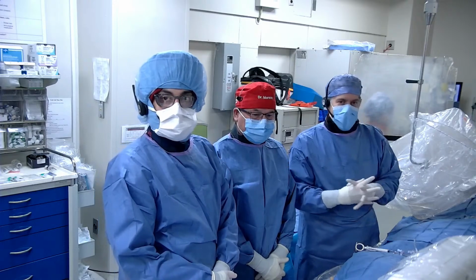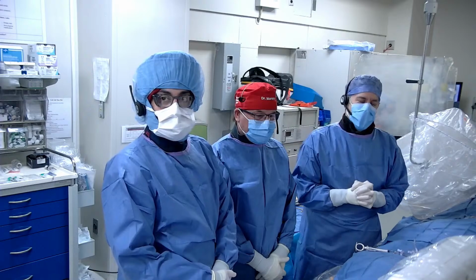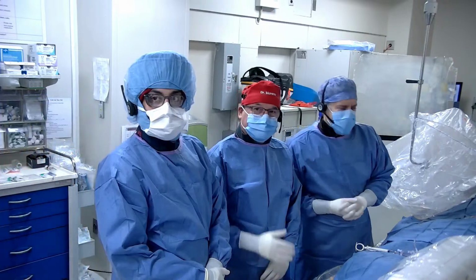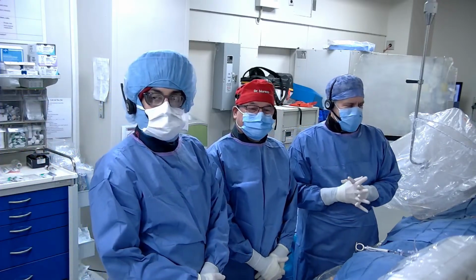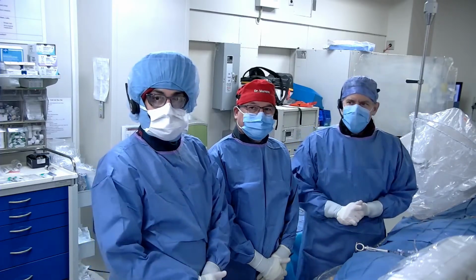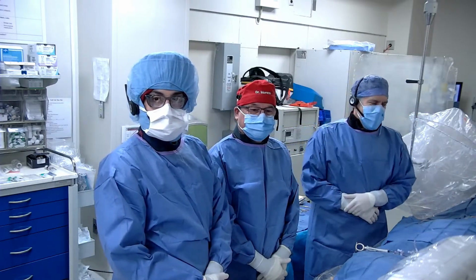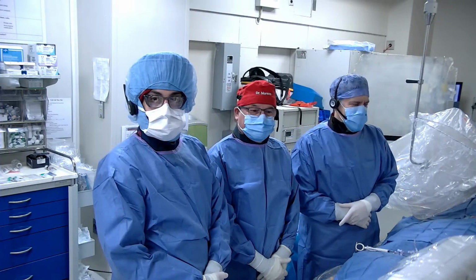I really want to thank my guest moderator, Dr. Nat Smilowitz, who's coming up from NYU. In the room, we have a full team here. To my right is Dr. Pedro Moreno, my esteemed colleague, senior attending here at Mount Sinai and an interventionalist. I have Dr. Jamarjeet here. He is one of our interventional fellows. We have Ornab, our technician, Ashley, nurse, and Will, our nurse. All kind of our core team with our physiology testing here at Mount Sinai.